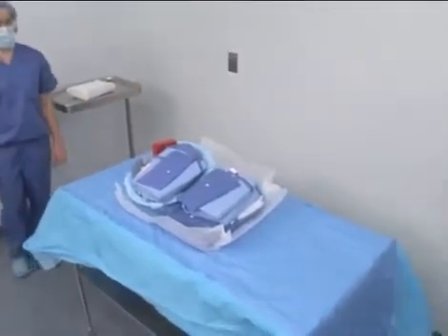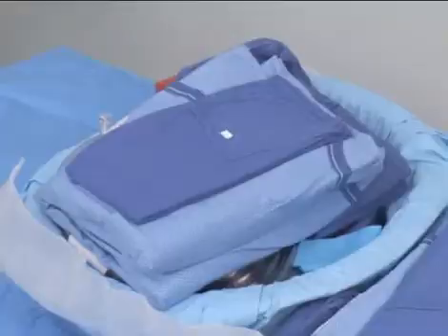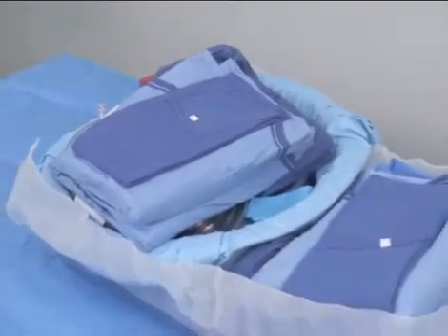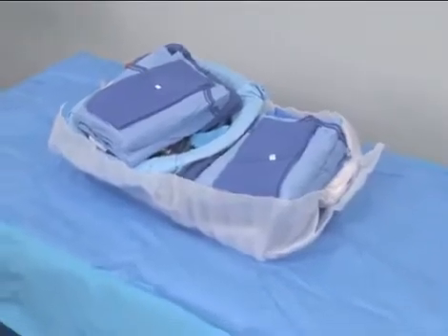Allow a 1-inch margin between the edge of the drape and your non-sterile hand. Remember not to lean over the table while opening the pack. Keep a safe distance away. Do not readjust the table drape after it is opened. After the large pack is unwrapped, instruments, suture packs, and other sterile items are opened onto the draped surface.